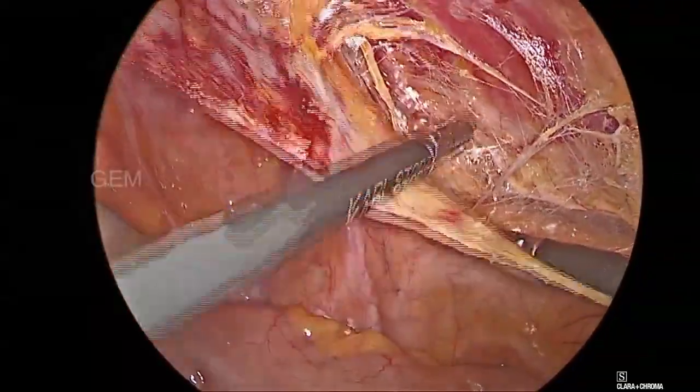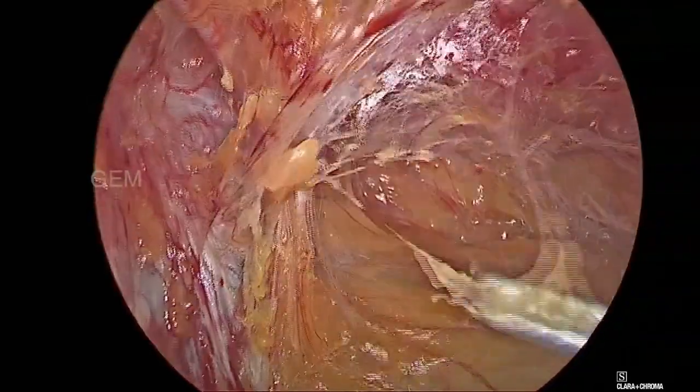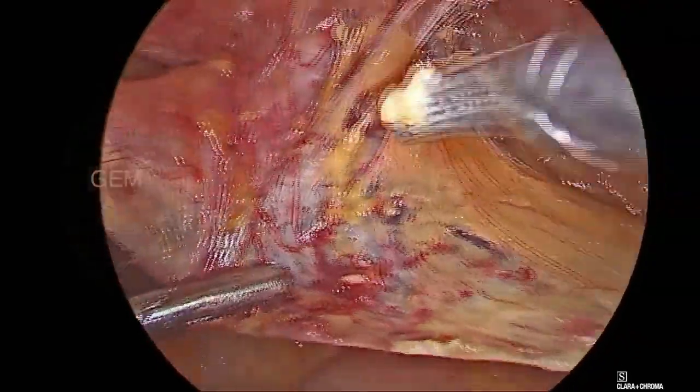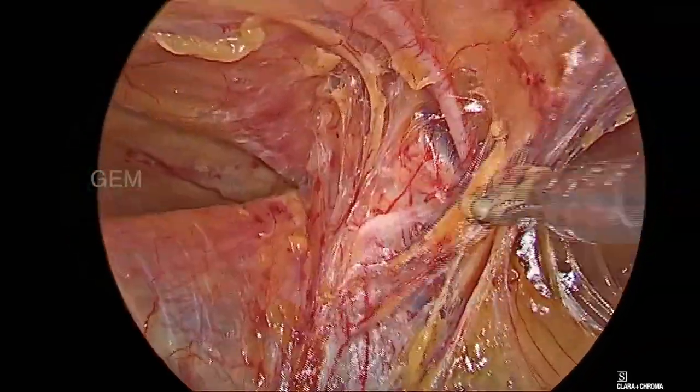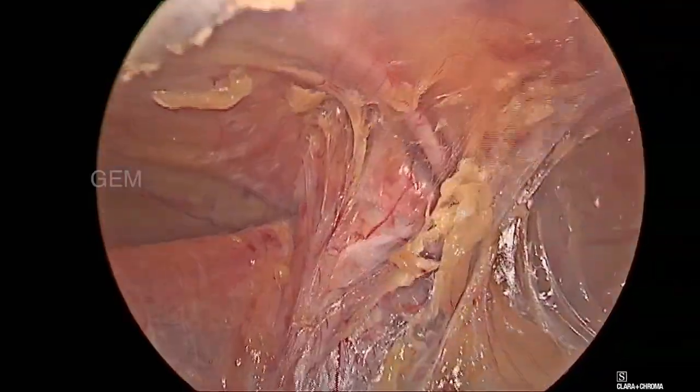Here we are doing a lateral space dissection and medial space dissection. You can see here the inferior epigastric artery.